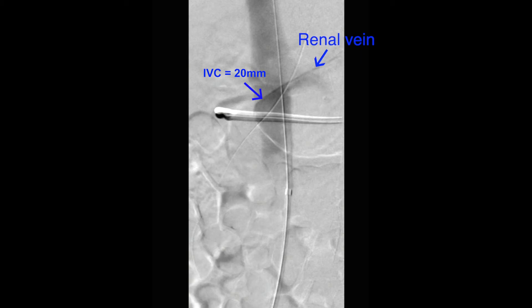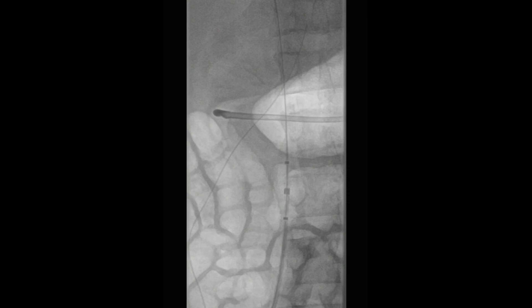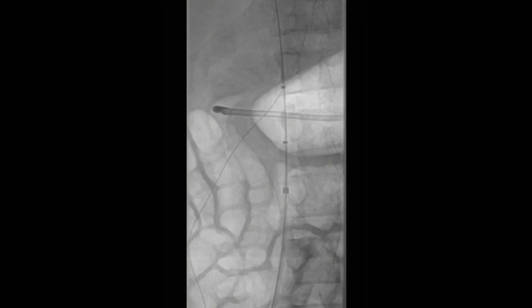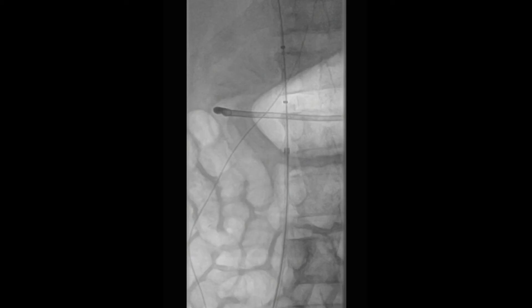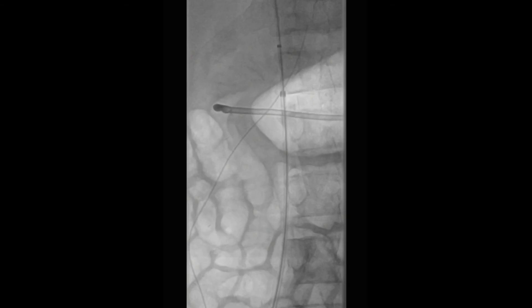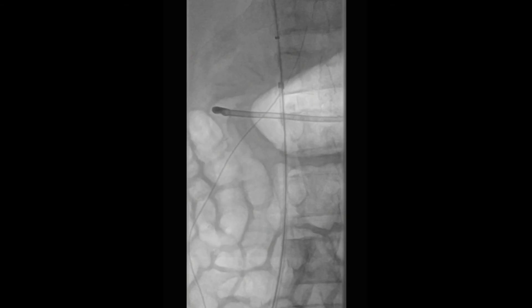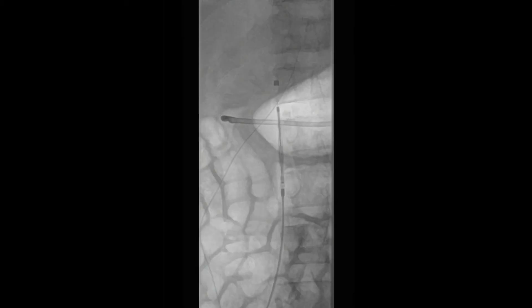A dilator is advanced through this sheath and the sheath is then gently advanced so the tip of the sheath is at the level of the lowest renal vein. The dilator is subsequently removed from the sheath and the filter is then advanced through the sheath.